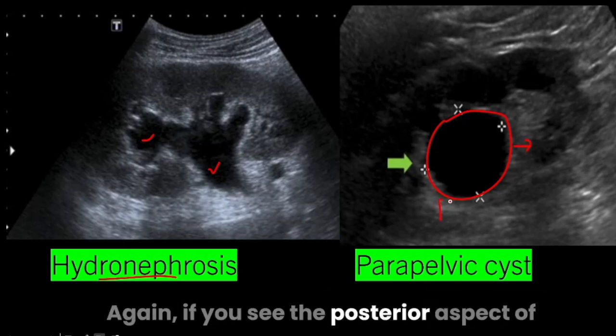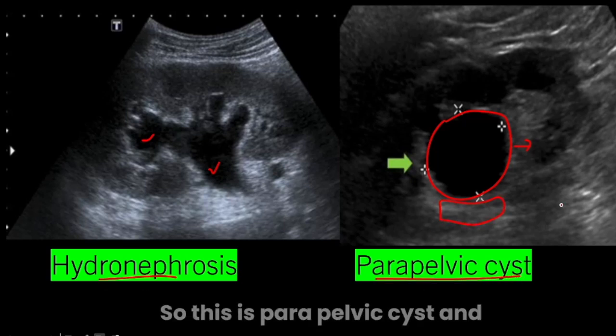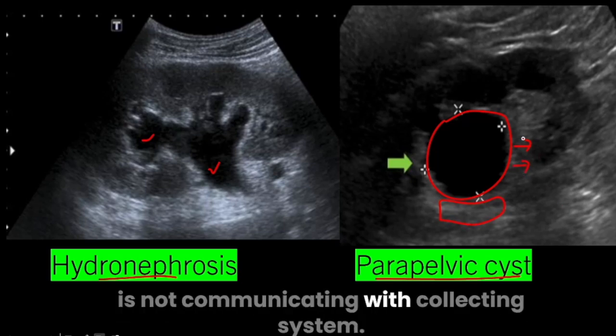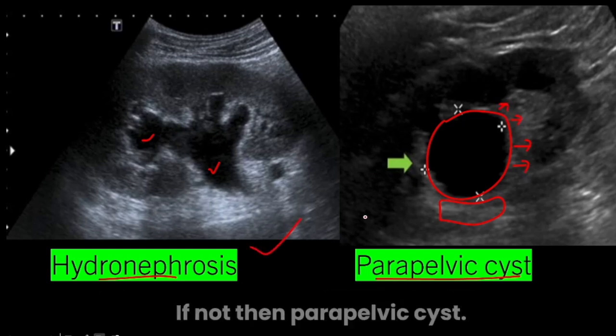Again, if you see the posterior aspect of this lesion, you can see posterior acoustic enhancement. So this is a parapelvic cyst and this is not hydronephrosis, as this cyst is not communicating with the collecting system. If it communicates with the collecting system, it is hydronephrosis. If not, then it is a parapelvic cyst.